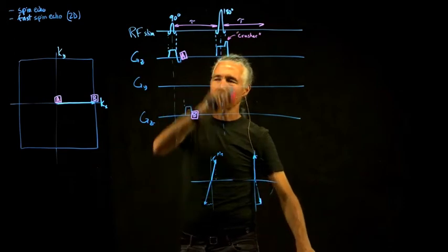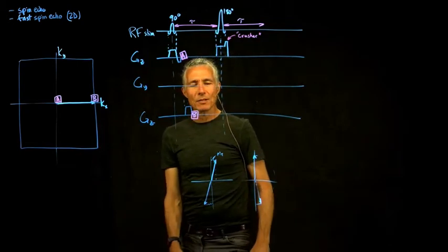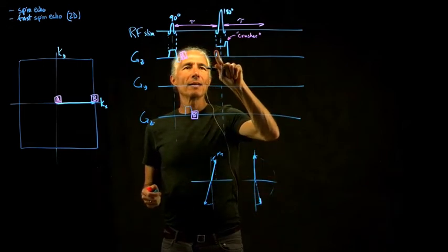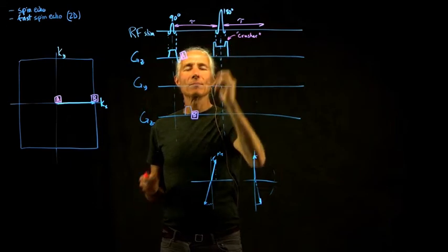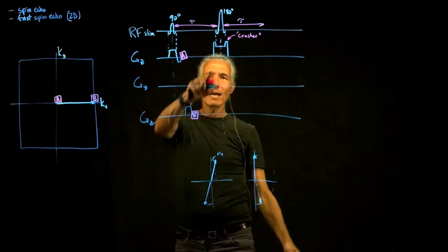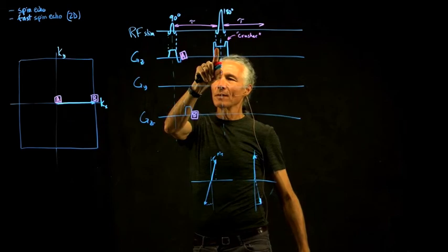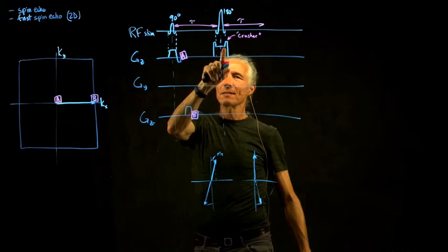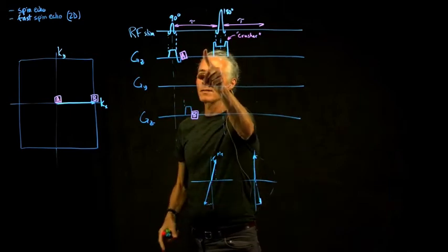that might have been generated by the RF pulse. But if there was some transverse magnetization that was generated by the original 90, for instance, we might want to keep that. And so we would put a little horn on this side also, and the reason it's up is because there's a 180 in between. What this up one is doing is pre-undoing the effect of the second one on whatever transverse magnetization might have been left at this point that we wanted to keep.